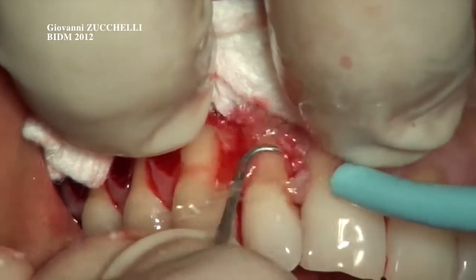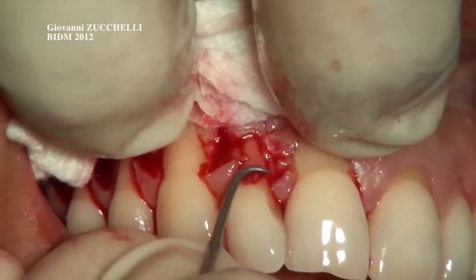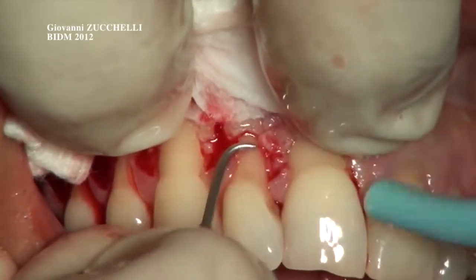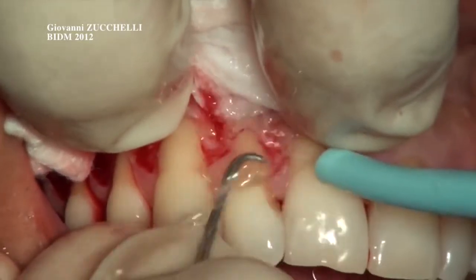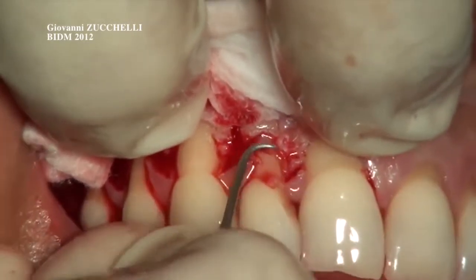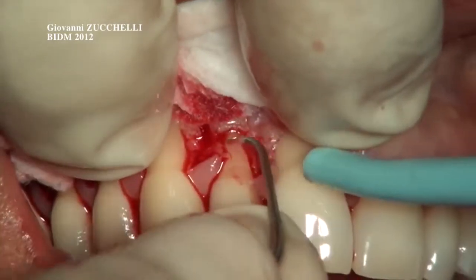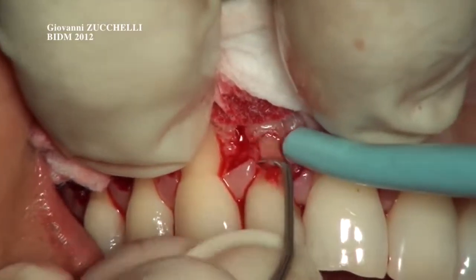You see that with my fingers I am making compression in the apical direction with the gauze and the flap inside, in order to reduce as much as possible the bleeding at the time of suturing. The mesial half of the lateral has been finished. Now, this section here. Now we are going to make root planing of the distal aspect.